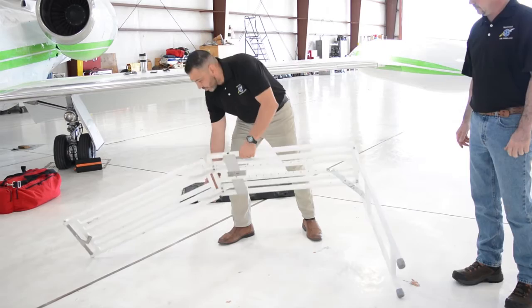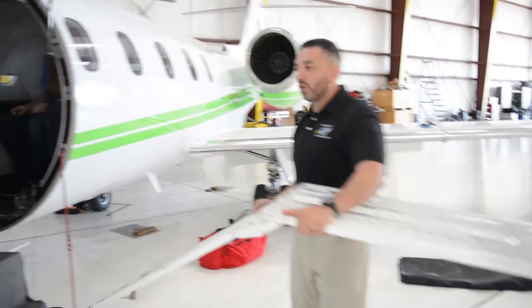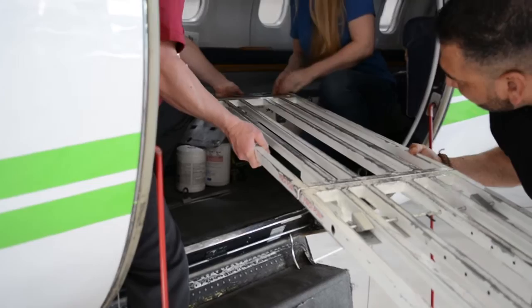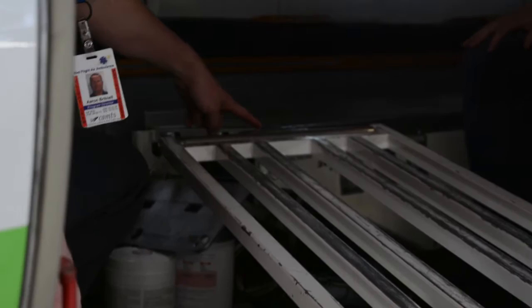So a couple of things with the aircraft. Again, we're going to remove our seat cushion. It's going to be stowed up, and then we're going to make sure our back bracket on the sled is ready. And then there we go. And we're going to just, that our round part is going to go right into its fitting there. Again, we're going to have the ramp at an angle so that the stretcher can miss the door jams. So this is ready to go.